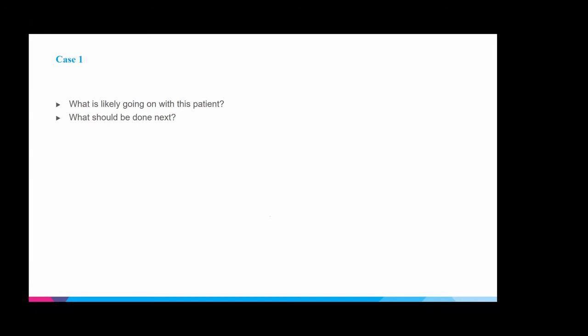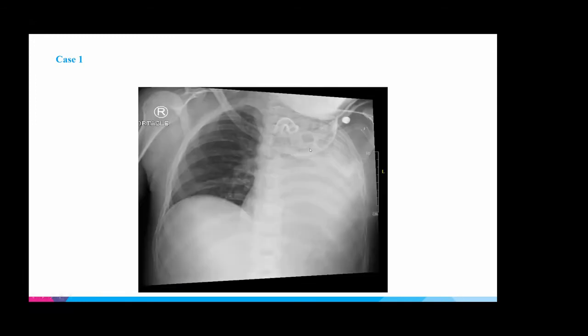So I would say, probably something that we don't necessarily do too much on the floor, but maybe would help, is deep suctioning, right? Like nasotracheal suctioning, if it is something like mucus plugging or deeper secretions, really going deep to try and suction out whatever might be stuck down there. So this patient did get an X-ray, so we can show you what the X-ray showed after our ultrasound view.